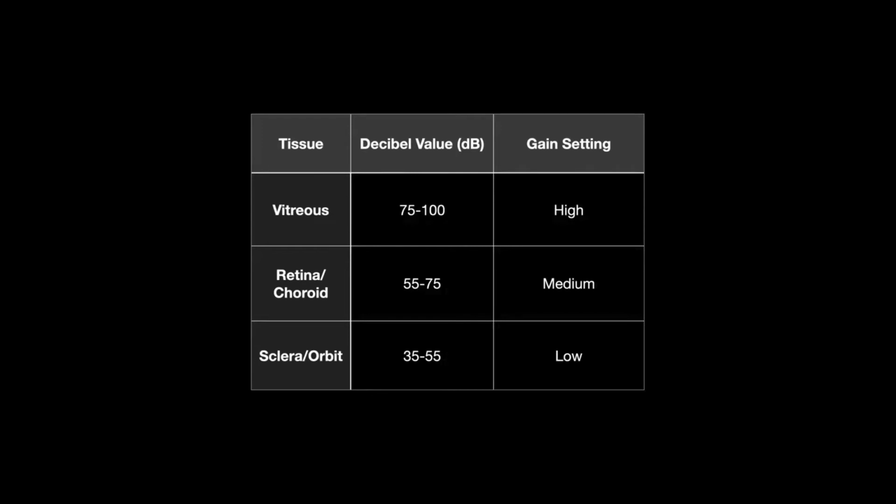As we'll see in the vitreoretinal disorders, when you turn that gain, you may make these subtle detachments come and go, and that may help you differentiate between a posterior vitreous detachment, which will go away with low gain and return with high gain, versus a retinal detachment, which may stay depending on the gain setting you have.